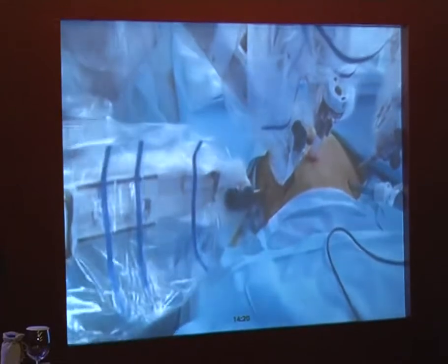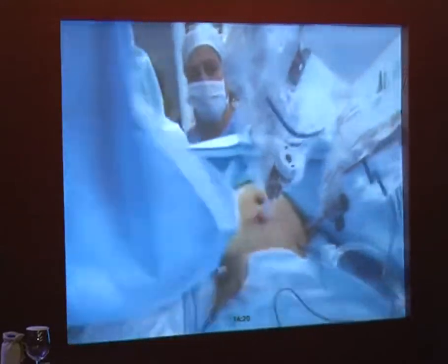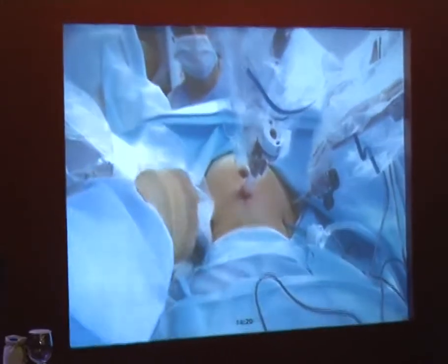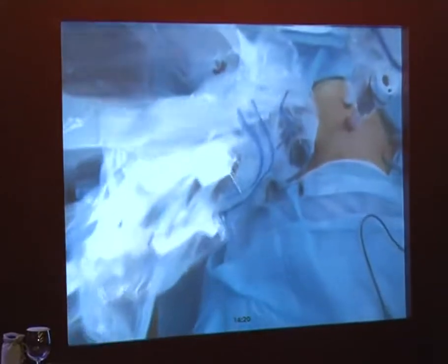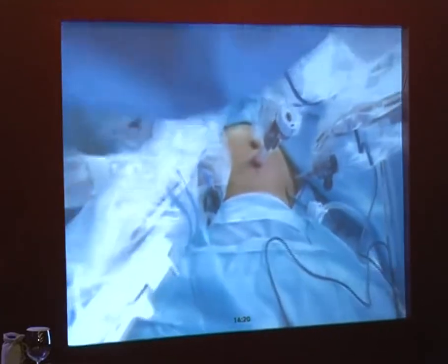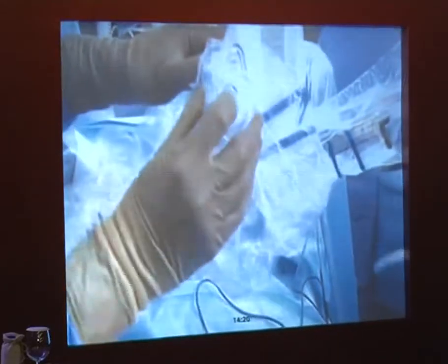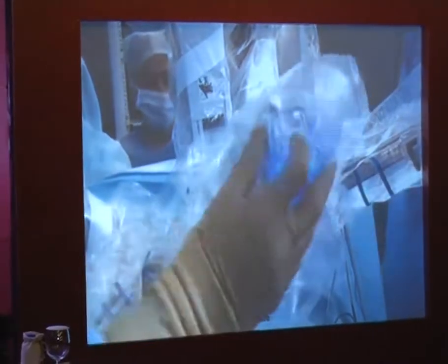So let me have the robot camera, because I need to see if we accidentally pulled the port out. Is there a scope? This is the uterine manipulator that we're using. We put a tip on the end of it that's custom fitted to the size of the uterus, and it's just metal. Do you have a tip? Oh, yeah, let's get a tip here. Show them that. Here's an example of a tip that we would normally put on the end of it, and I think we used this very tip in this patient.